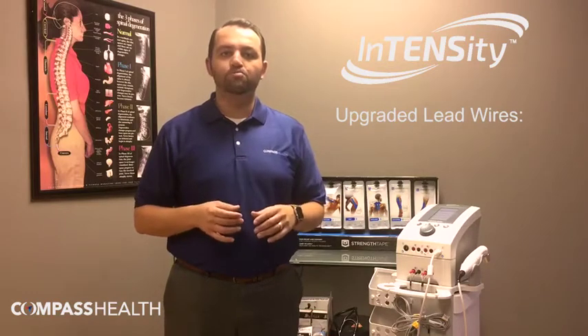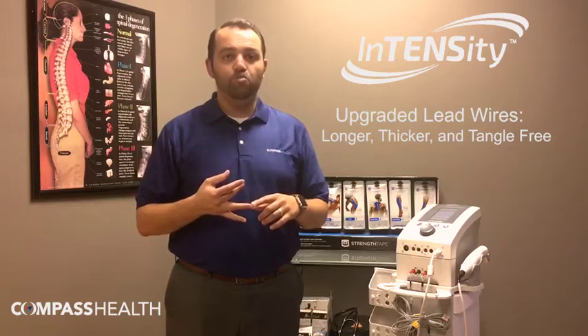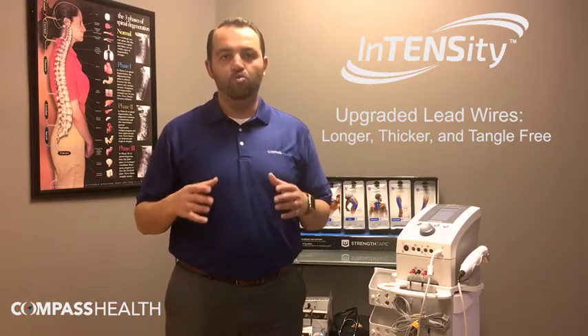Another upgrade is in our lead wires, which now comes standard with every device. Those upgrades include making them longer, making them thicker for a more stable current flow, as well as using a new rubberized material that allows for a tangle-free work environment.